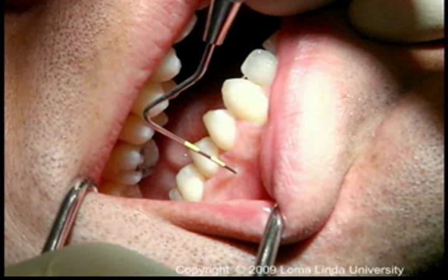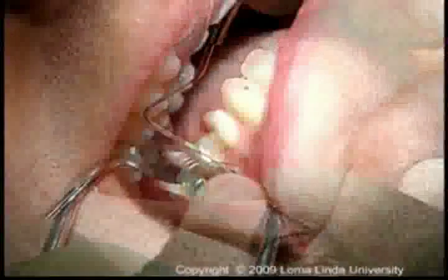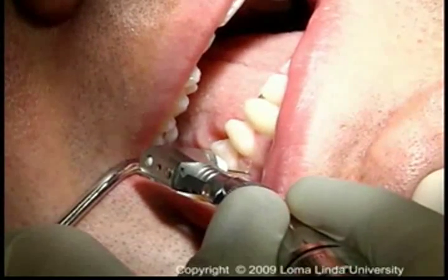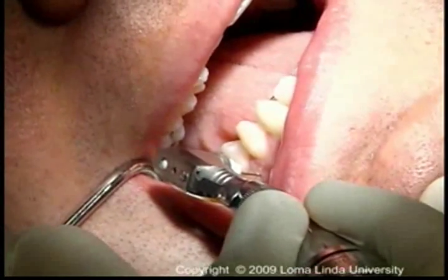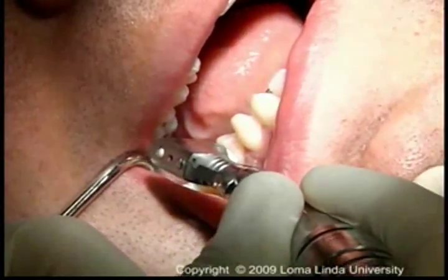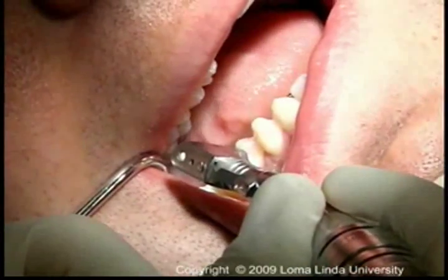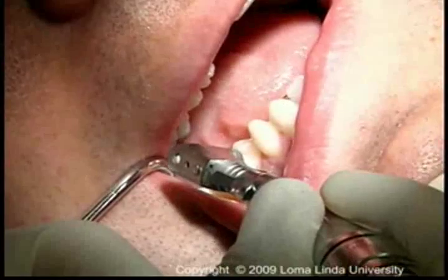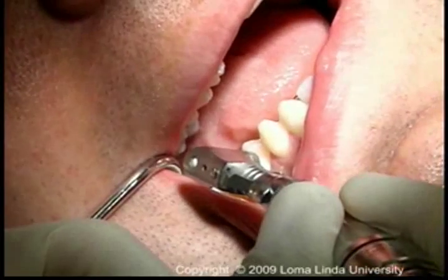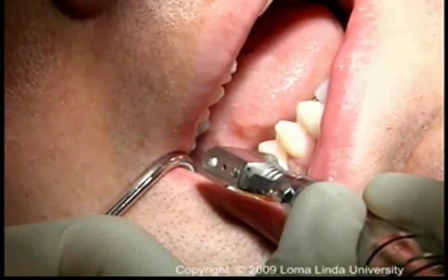This shows the location of penetration, which is in the interradicular space with the attached gingiva slightly apical to the cervical margins of the crowns. The perforator, or number 2 round burr, is positioned and advanced slowly. Use alternating pressure or a type of pecking action. If the perforator is not advancing, it has become dull and must be replaced. If it is not replaced, the perforator may bind and break or create frictional heat and burn the bone.